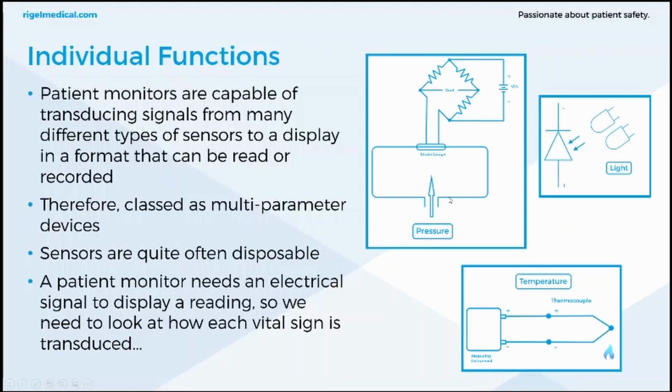So you're measuring direct pressure via this, typically a fluid filled catheter, and that changes the pressure. It's a fairly simple way of measuring pressures.